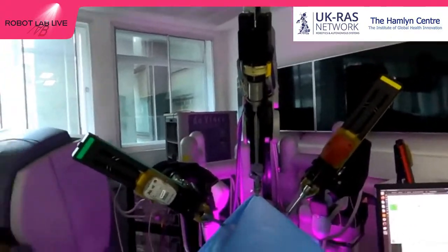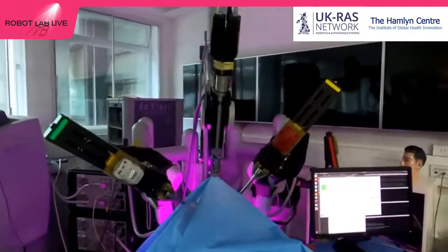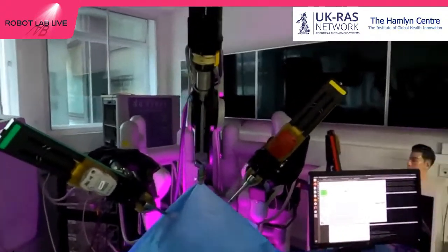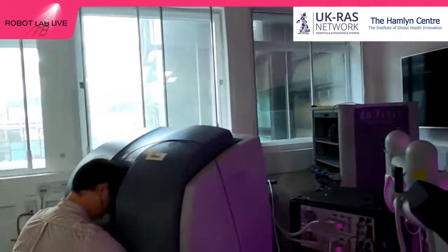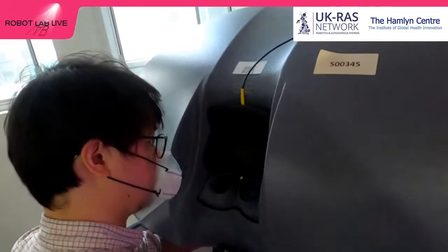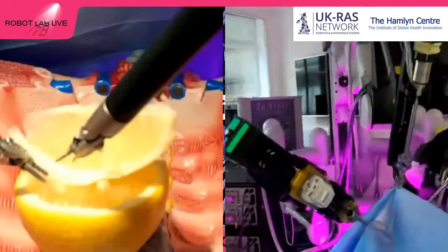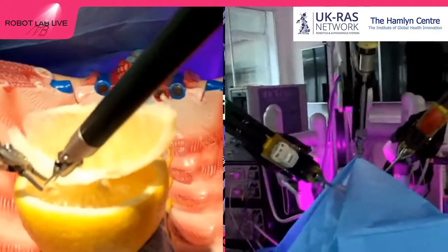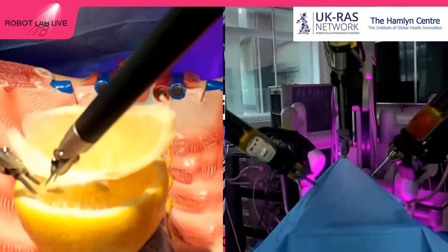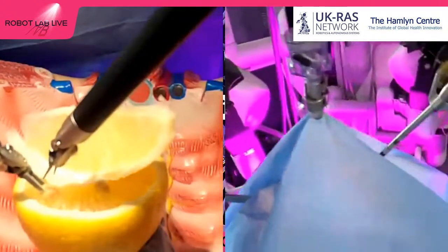And you may ask now, but how does he know what he's doing inside the patient? And for that, we have the arm in the middle. And so that arm is a stereoscopic camera that is looking at what the arms do. And it's sending that video in real time to Sen, who has a 3D vision through those goggles that you can see there, and through those eyepieces. And he has a 3D vision of everything that is going on inside. So in summary, with this robot, it's as if you go inside the patient with your eyes, your hands, everything, but only through 3 very tiny incisions, as you can see here.